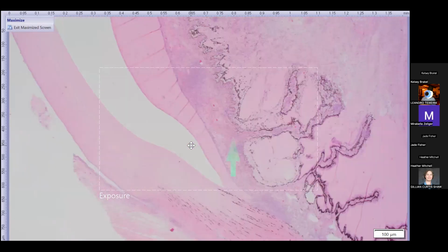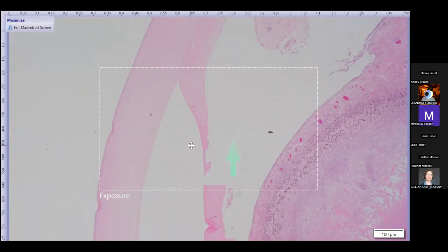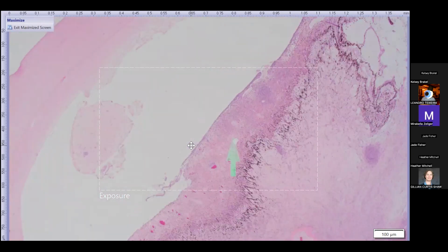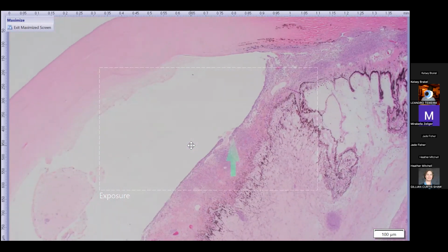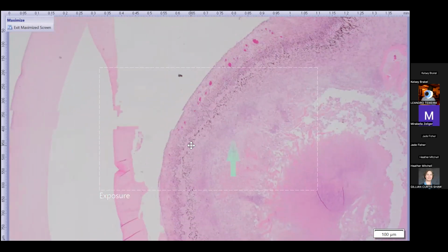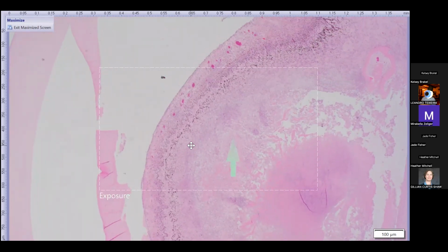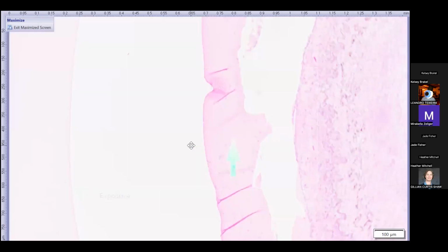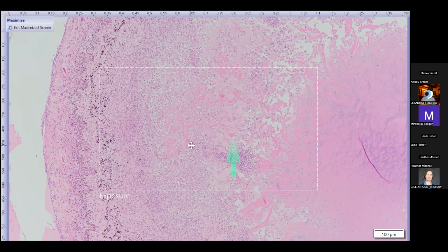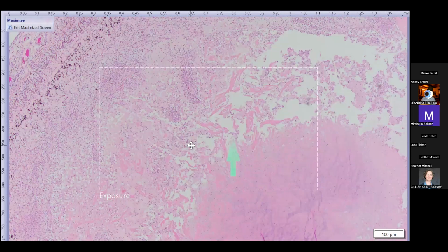All right. So cruising around, again, we can see this nice proteinaceous material in the anterior chamber. And here is our iris. I don't think we have a very good section of the pupillary margin here since I had to flip it over so we could make sure to get a section with the stick in it. But everything is infiltrated by lots of macrophages and neutrophils. Here is what's remaining of our lens fibers.